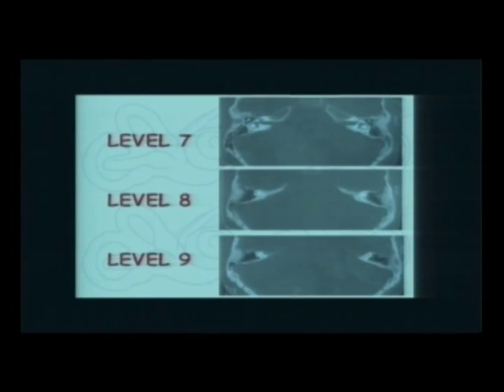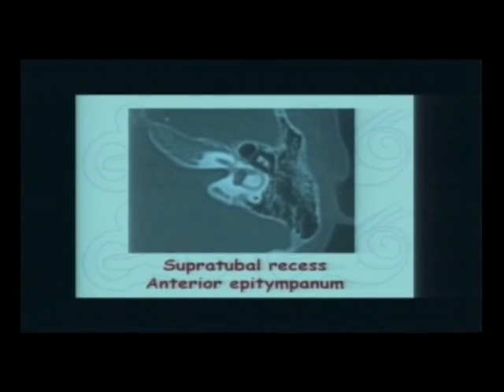You find that the superior canal differs from the posterior, in that the posterior is along the axis of the temporal bone, the superior is across the axis, it's perpendicular to the axis of the temporal bone, and you see that the lateral semicircular canal appears nicely like a bucket handle in this area. Let's have a few important structures. If we see, this is the handle of the malleus, this is the head of the malleus, and behind it, this is the incus, and this is the attic.